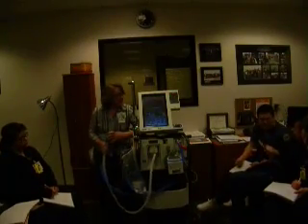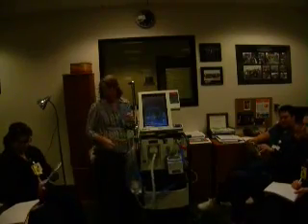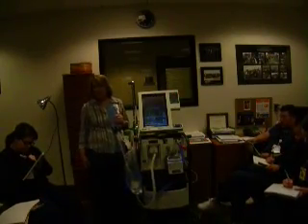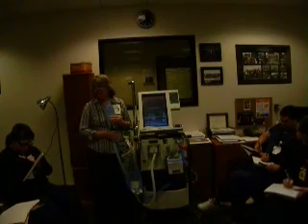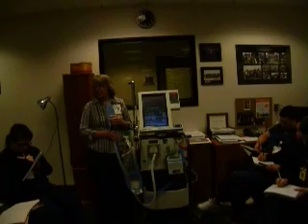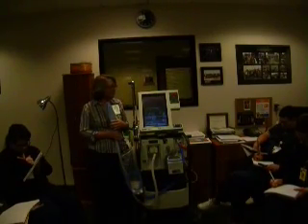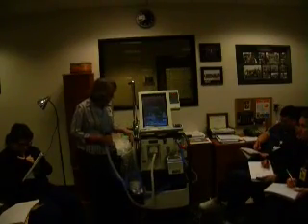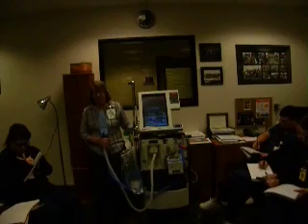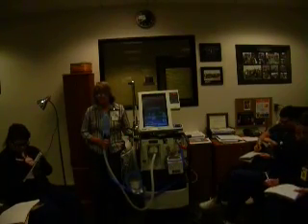Okay? All right, so let's see. Oh, there is apnea setup. That's your apnea backup. So if your patient goes apneic, the machine will kick in and breathe. Default time is 20 seconds. Other than that, unless your patient's on a really low rate, it'll be set the same as your settings are. But always 100%. Apnea backup will always be at 100% no matter what the FiO2 is, because if our patient went apneic, we want to provide the support for them.